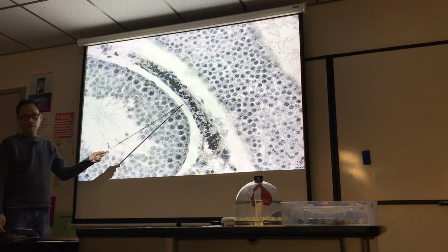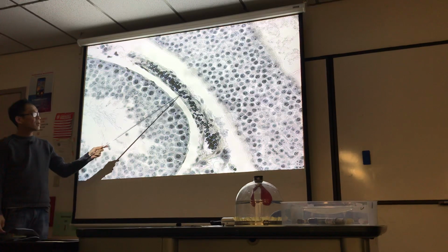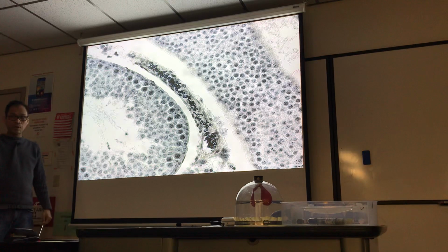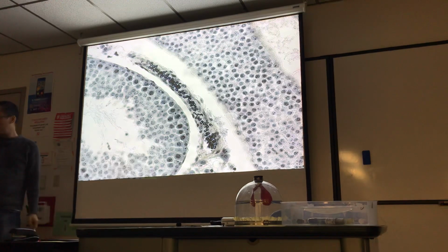That's my capillary. That's a good example of a capillary. It barely accommodates the width of just one red blood cell, so we'll go with capillary for that. And so the definition is, how many layers? One. And what's the layer if I had to identify it? TI. Tunica intima. Let's move on.